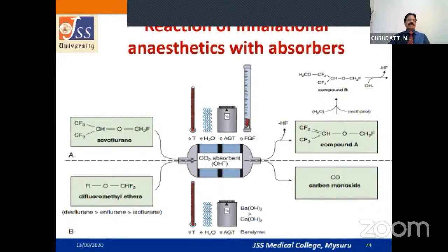And again for desflurane, whenever the temperature is increased, with dry, desiccated soda lime, and when the agent is being used at a higher concentration, desflurane can interact with soda lime to produce, sorry, carbon monoxide. Carbon monoxide can produce a lot of problems for the patient. It cannot be detected by our regular 2-wavelength pulse oximetry, and that's how it cannot be detected by us during the intraoperative period.